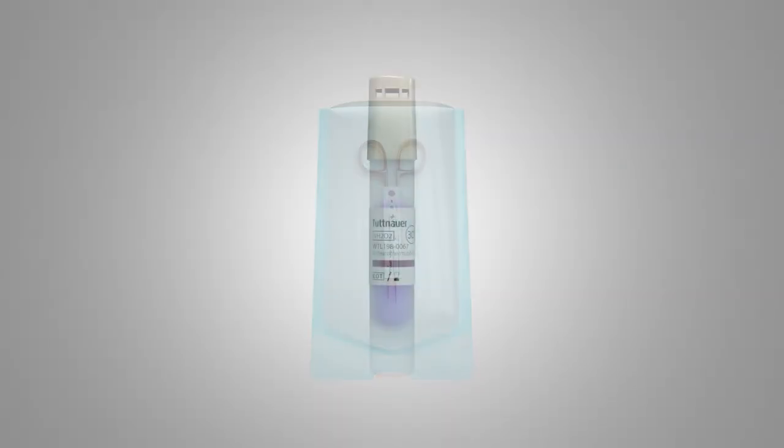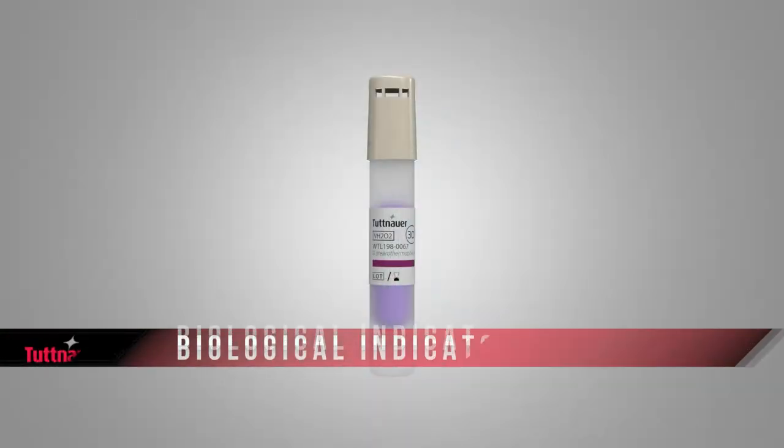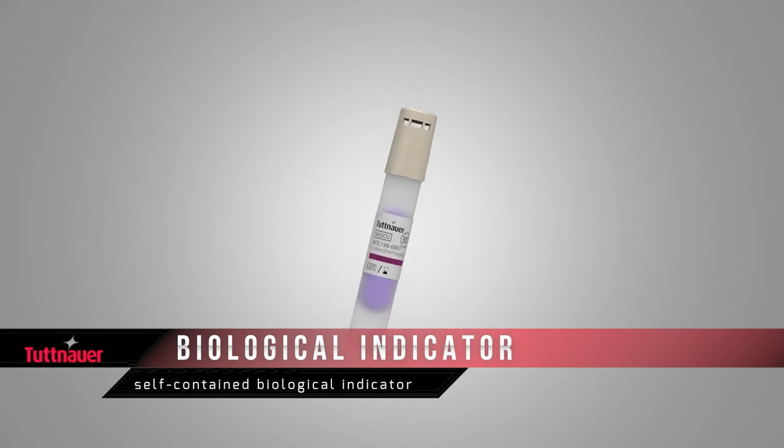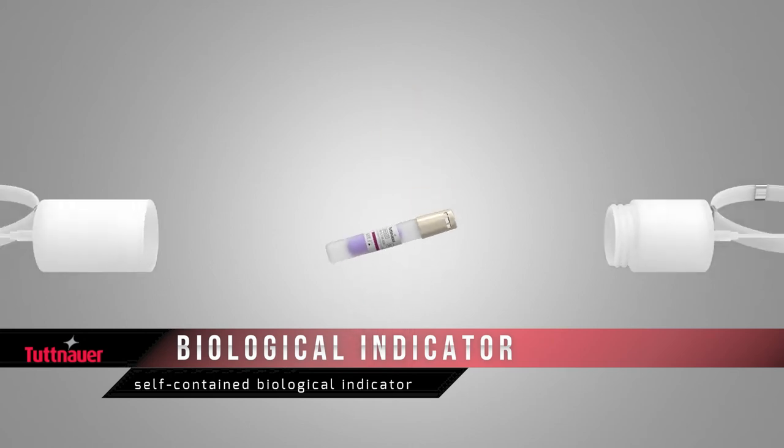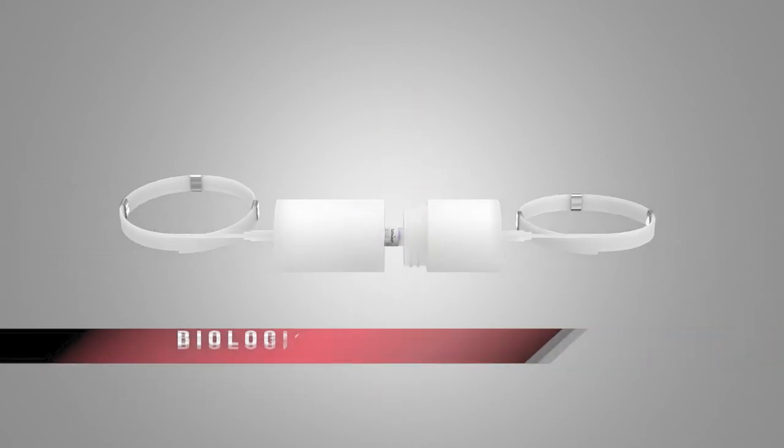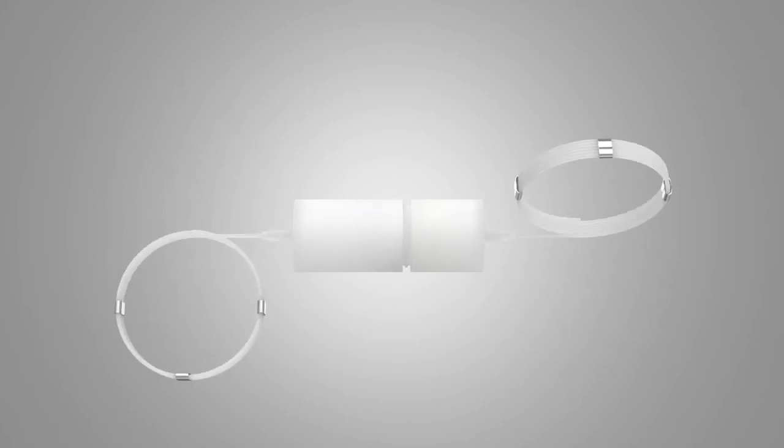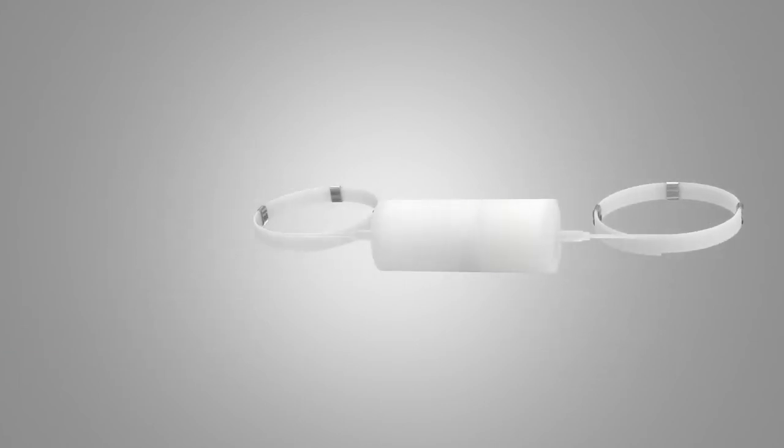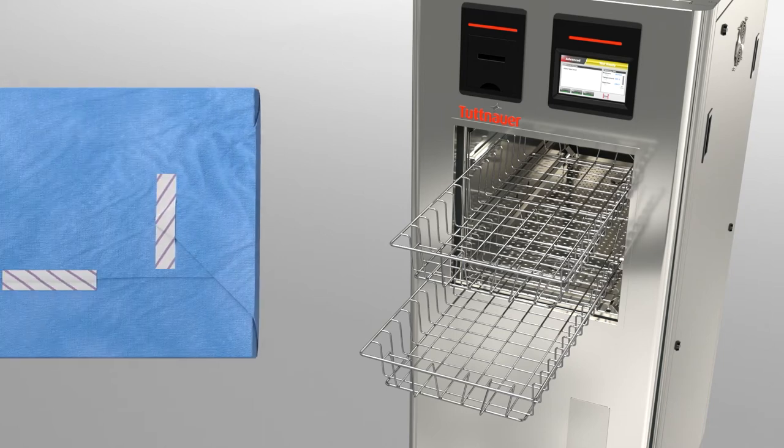Our self-contained super rapid biological indicator provides reliable results in record time and speeds up your workflow. The biological indicator is placed in the process challenge device.